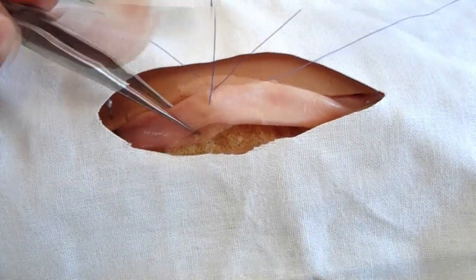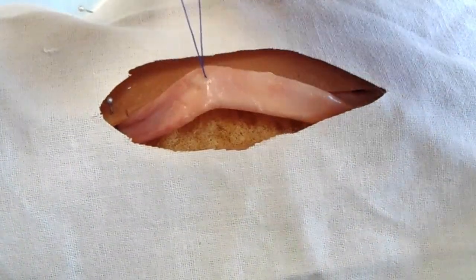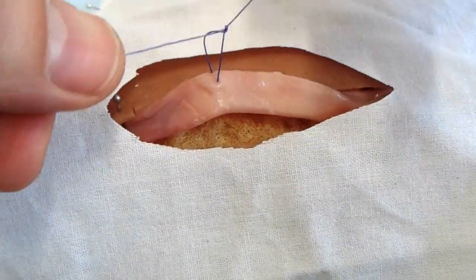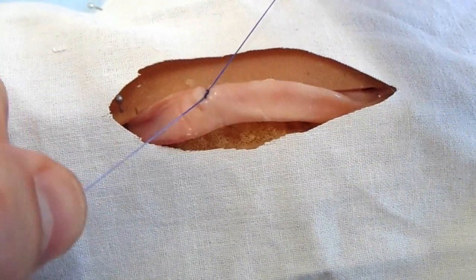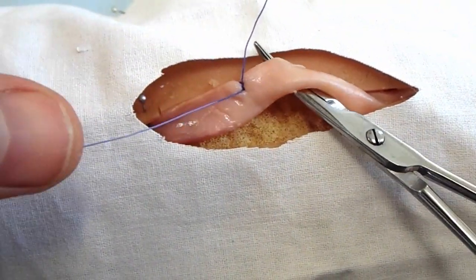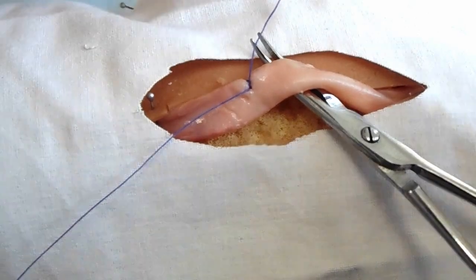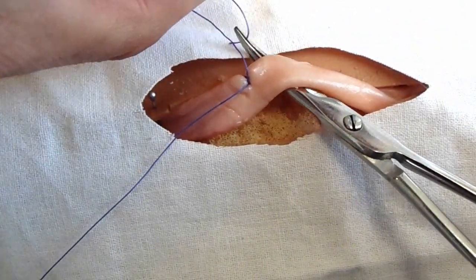After suturing through the vessel diameter with an atraumatic needle, a surgical knot is made on one side of the vessel in the proximal part of the operative wound. By means of mosquito forceps, one filament is put round the second half of the vessel and a simple knot is made.